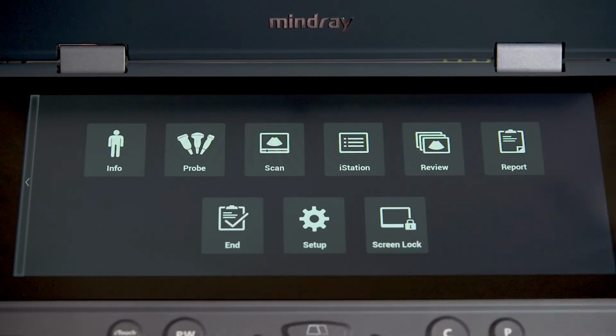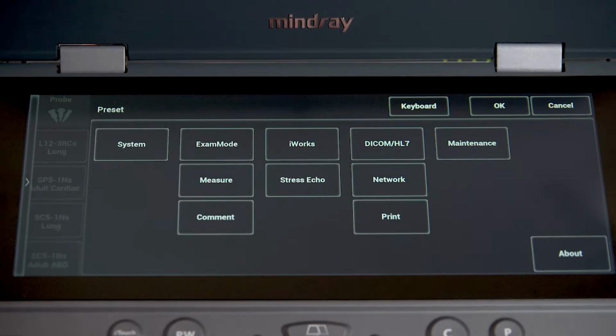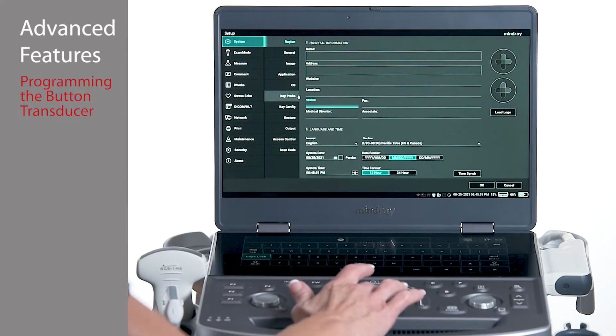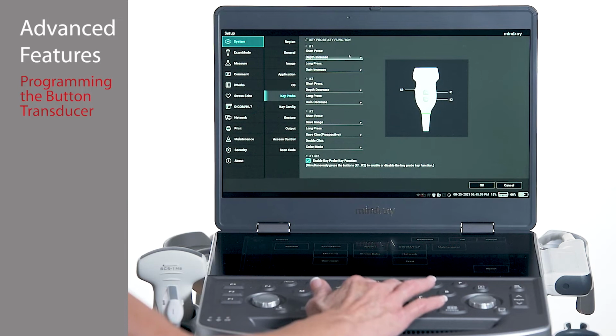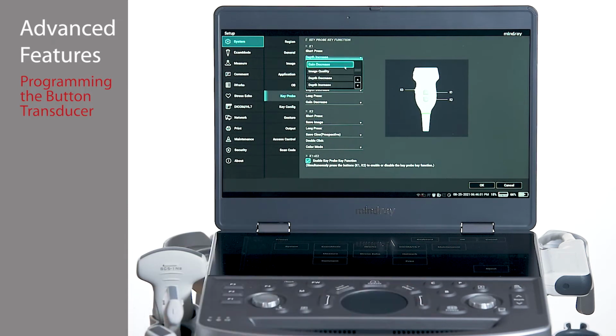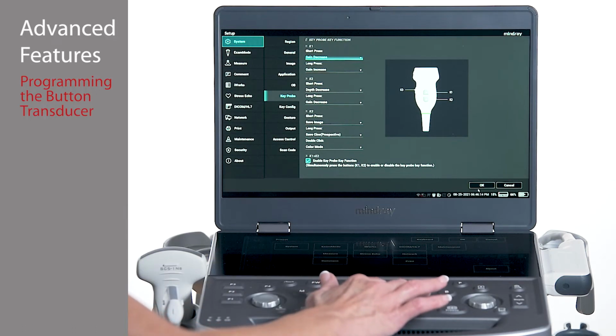To program the L12 transducers, access the main menu, tap Setup, and select Key Probe. This displays an illustration of the transducer and applicable button keys. Use the drop-down arrow next to each button to select the desired function or functions. There is the ability to program a short press, a long press, and on K3 a double click as well. Make desired selections and tap OK at the bottom of the screen.